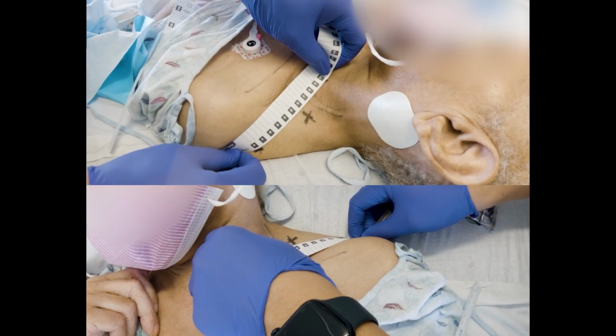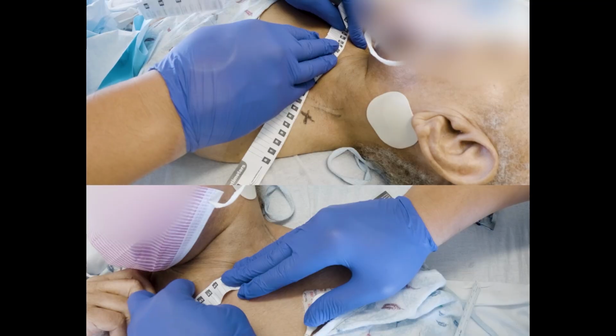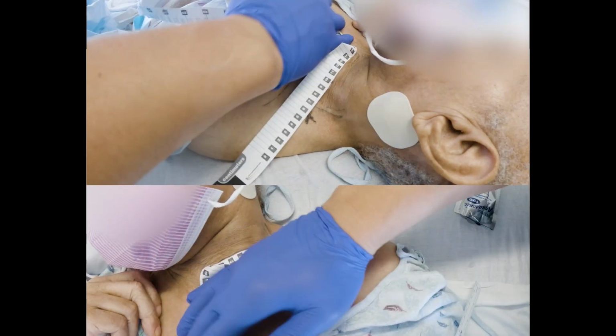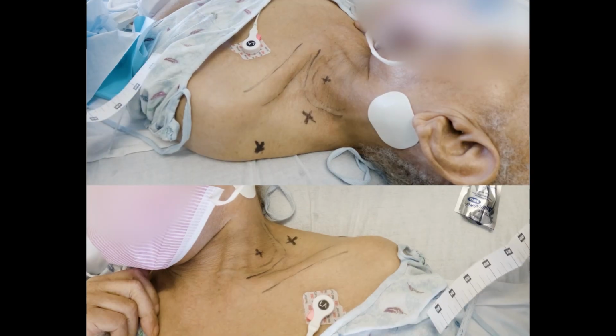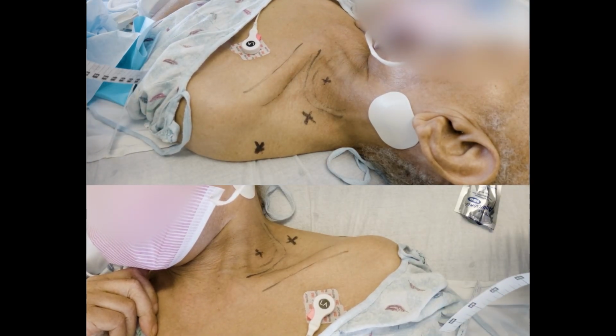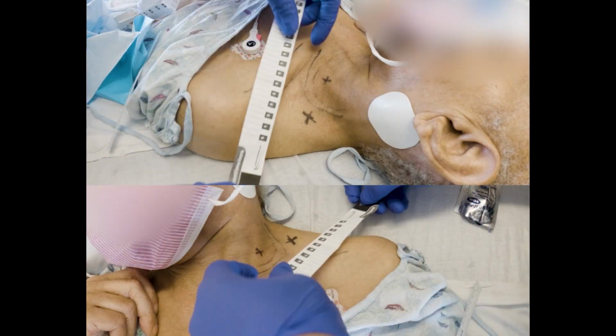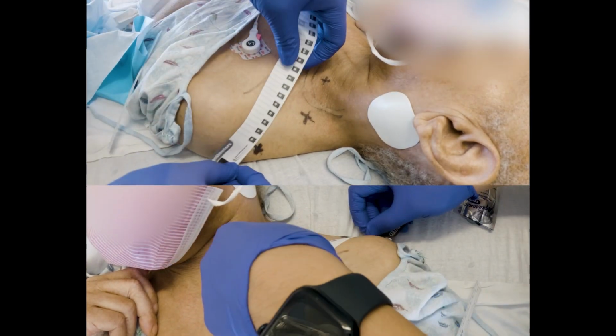So we got here to here, it's about 10. From 10 to the right clavicular joint, about 19. From 19, 1, 2, 3. So I'm getting about 29, 1, 2, 3. So I'm getting 32, so 31 or 32. Because I have a secure cath, I can actually afford to be longer. So we're going to shoot for 32, let's make sure.